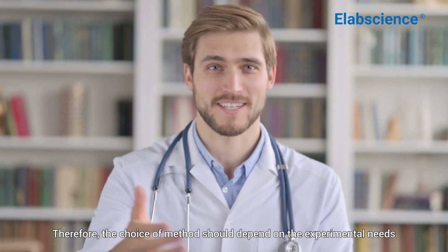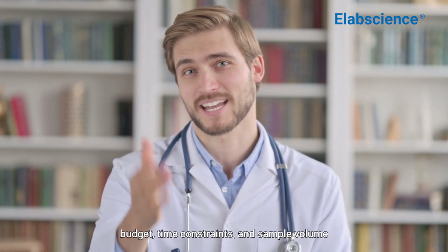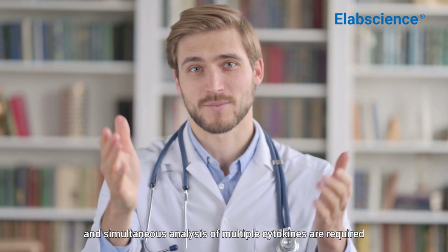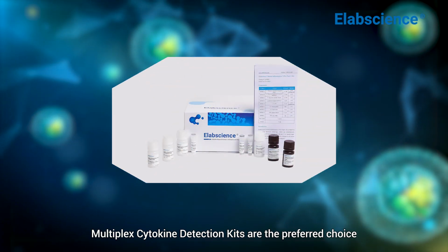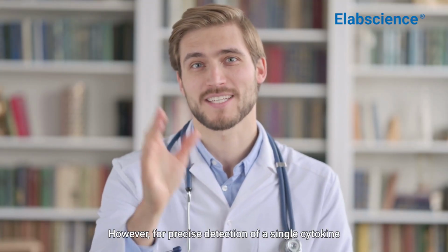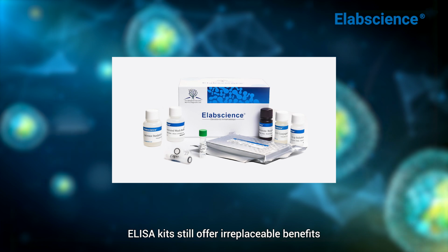Therefore, the choice of method should depend on the experimental needs, budget, time constraints, and sample volume. If high-throughput detection and simultaneous analysis of multiple cytokines are required, multiplex cytokine detection kits are the preferred choice. However, for precise detection of a single cytokine, ELISA kits still offer irreplaceable benefits.